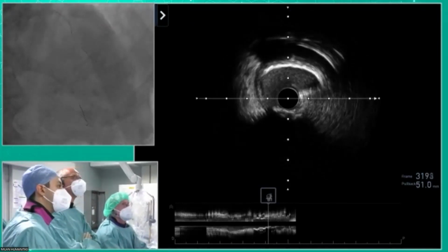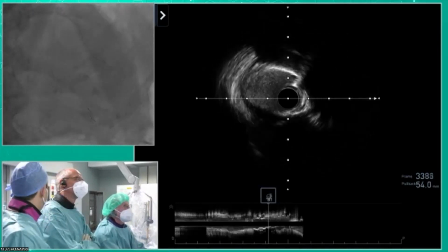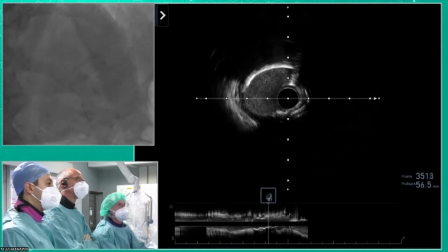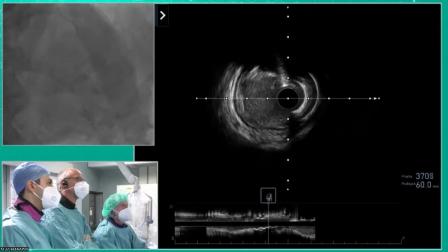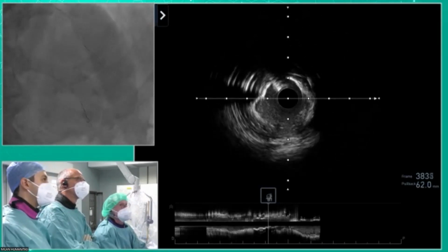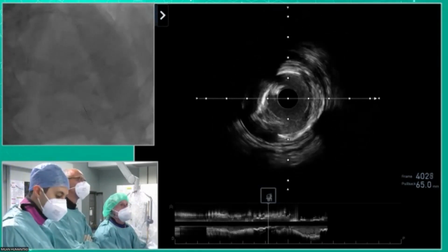Yeah. It's interesting though, the calcium, except for that one area where it's concentric, is largely eccentric. And that area where it was concentric was distal to the diagonal. Yep. And I tell you, if we place a stent there, we're going to kill that big septum. I don't want that. So now we are going closer to the proximal lesion where we did the trio balloon. The calcium is broken.